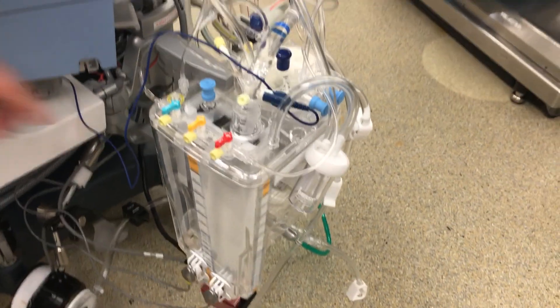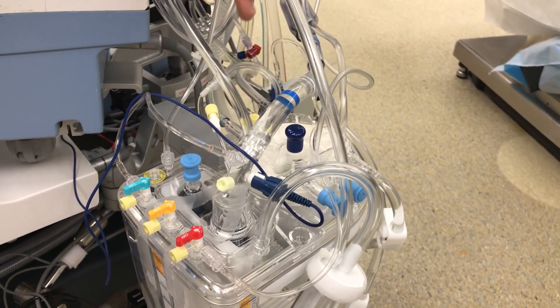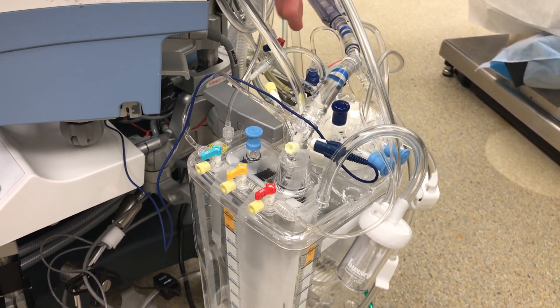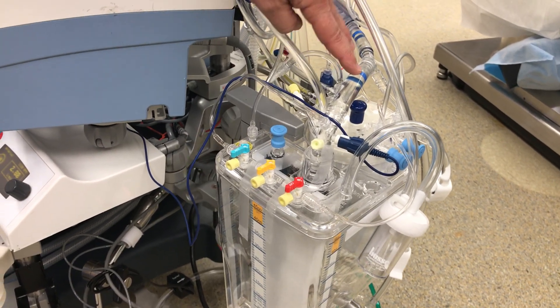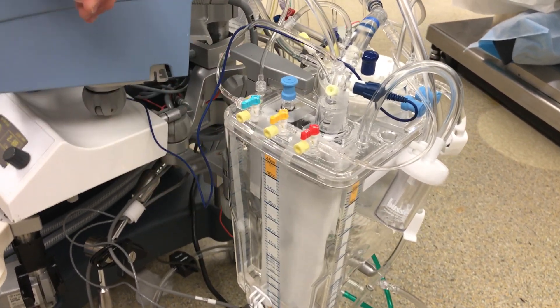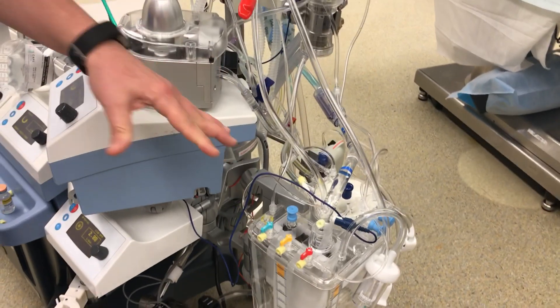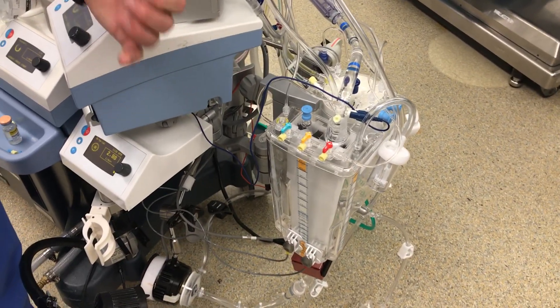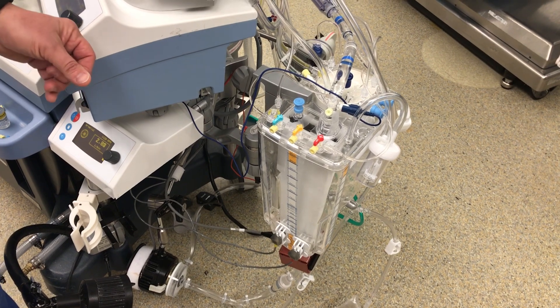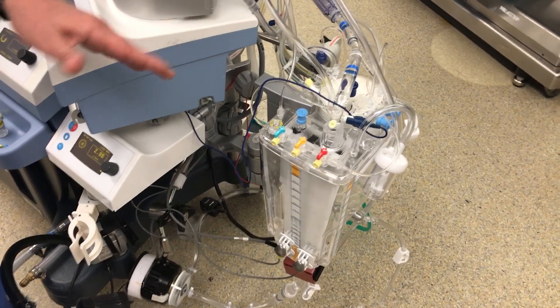Does the reservoir have filters? The reservoir has a gross filter inside. Even though this plastic does not peel off much, if for some reason tiny pieces of plastic or dust are in there — most of those would be sterilized in the sterilization process — any tiny particles that come back will be trapped by the gross filter inside and also by the finer filter on the outside. We do not have an arterial filter anymore. It used to be a staple, but the process of keeping the blood filtered and clear of tiny particles is so good now that arterial filters are not used everywhere. The oxygenator itself will really stop the majority of bad things.